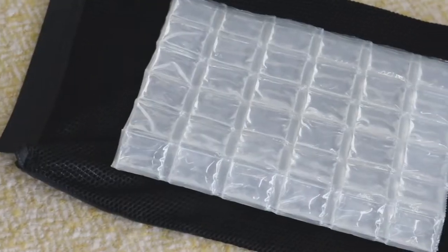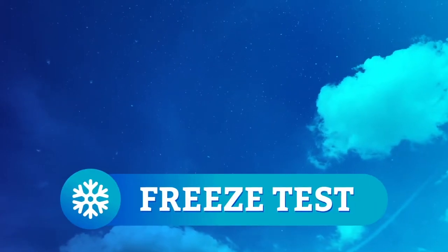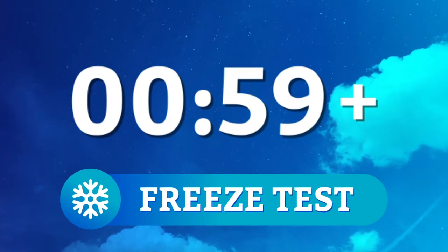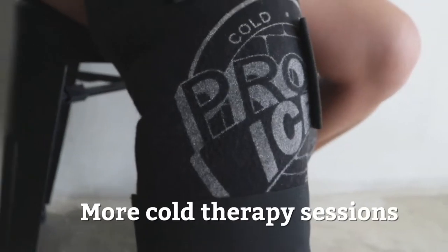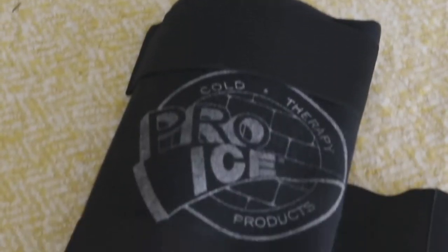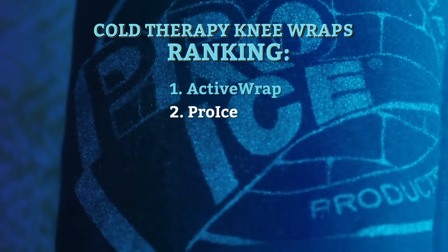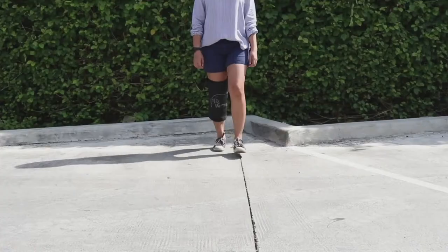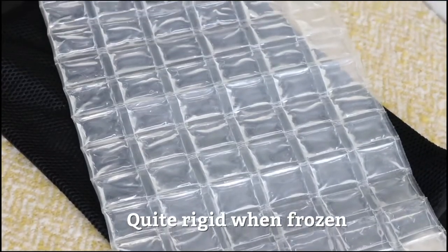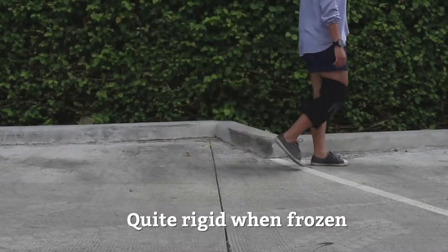If you're worried about placing this large cryo blanket in the freezer, don't worry — it's foldable. During our freeze tests, the cryo blankets stayed cold for more than an hour. The longer the packs stay cold, the more cold therapy sessions you get, so this really works to your advantage. Overall, we think that ProIce is an excellent knee wrap — super customizable and can stay cold for a long period of time. Perhaps the only downside is that the bigger PI-420 model can be quite rigid when frozen. It still allows mobility, but some people may find it a bit stiff compared to the PI-400 model.